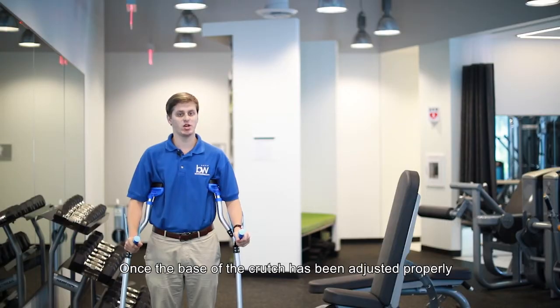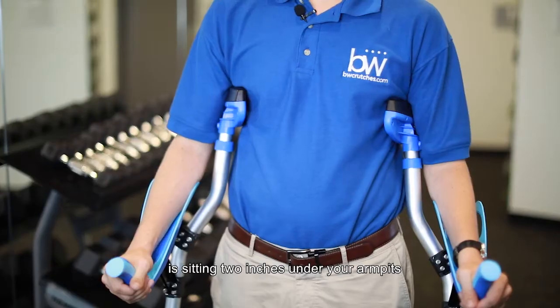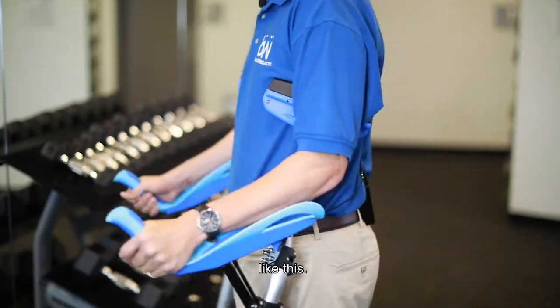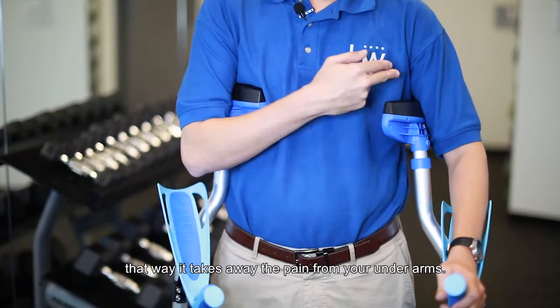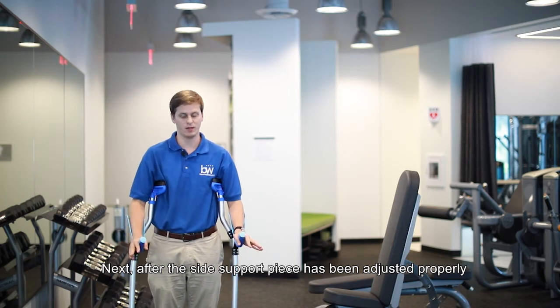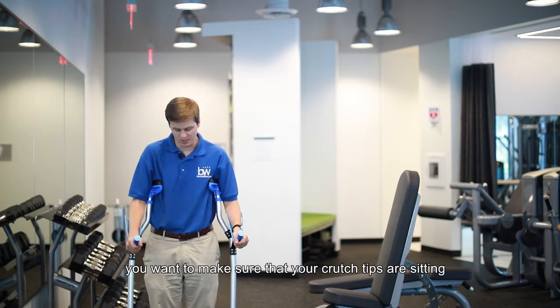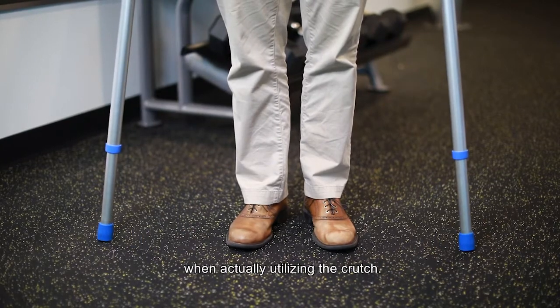Once the base of the crutch has been adjusted properly, next you want to make sure that the side support piece is sitting two inches on your armpit, like this. You want to make sure that you can fit two fingers under it — that way it takes away the pain from your underarms. After the side support piece has been adjusted properly, you want to make sure that your crutch tips are sitting about 6 to 8 inches wide, that way it helps you balance when actually utilizing the crutch.